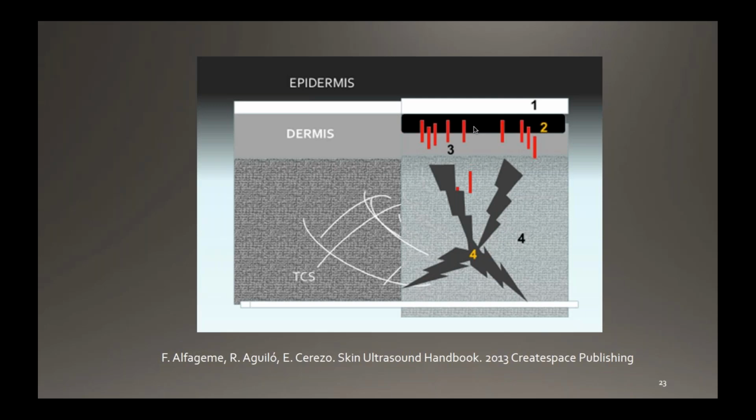And the very patient requires us this dermatologic ultrasound. We have been teaching our patients that dermatologic ultrasound is important because we can personalize the treatment to his or her case.